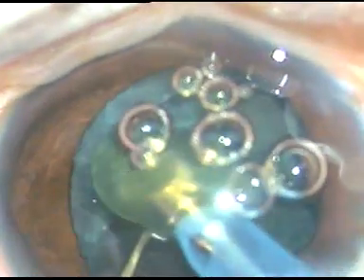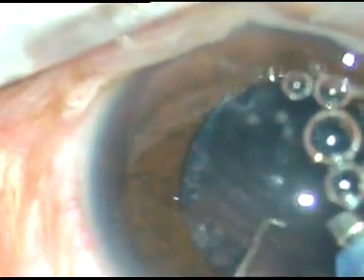I try to engage it and lift it. With the help of the Simcoe cannula, I have lifted this hemi-nucleus out of the capsular bag. I inject some viscoelastic behind, then go with the chopper first and then behind the semi-nucleus and remove it using very little phaco energy — about 20 to 25% — and vacuum. The epi-nucleus is then removed. The nucleus and epi-nucleus have been managed.